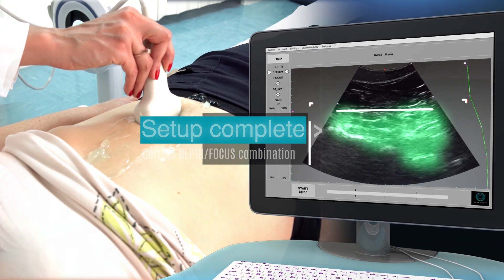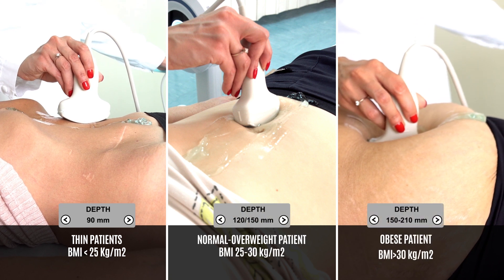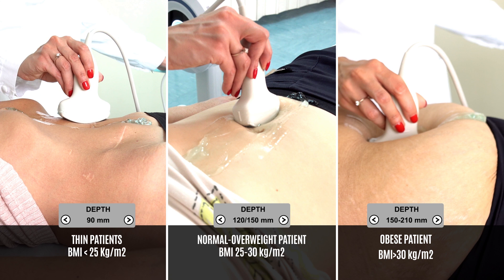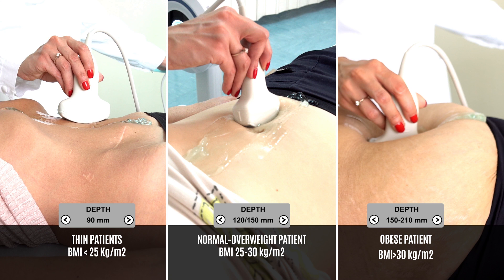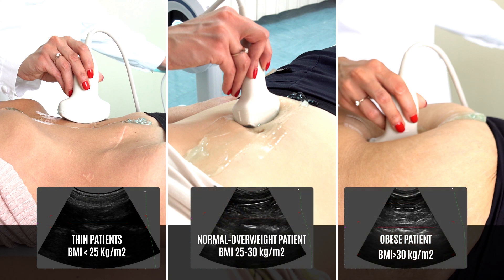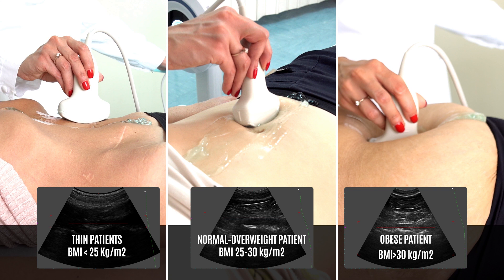It is possible to perform a scan on all patient types. The depth of scan should be set according to the patient's BMI. For thin patients with a BMI lower than 25 kg per square meter, the depth of scan should be set to 90 mm. For patients with normal weight or overweight with a BMI between 25 and 30 kg per square meter, set a depth of 120 to 150 mm. For obese patients with more than 30 kg per square meter, set a depth of 150, 180 or 210 mm.